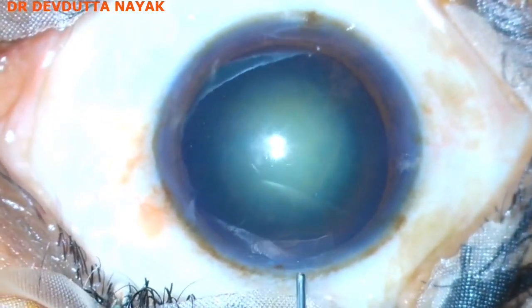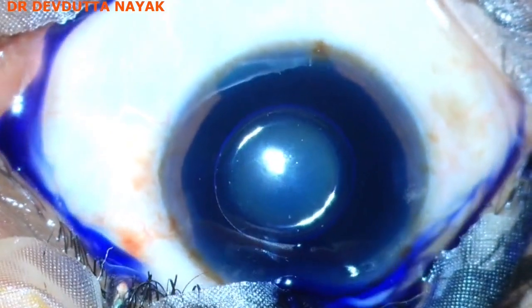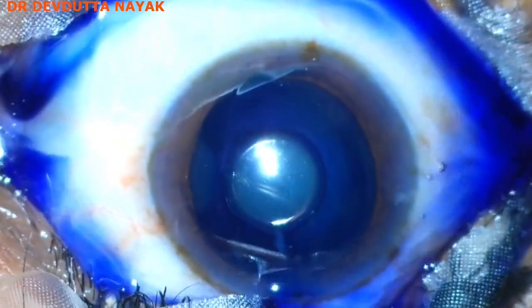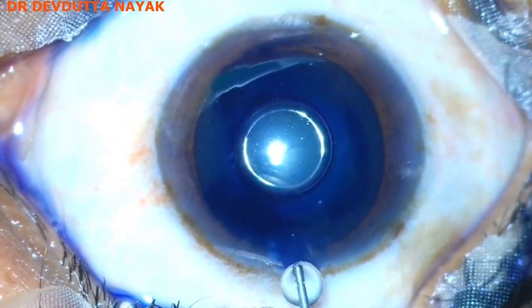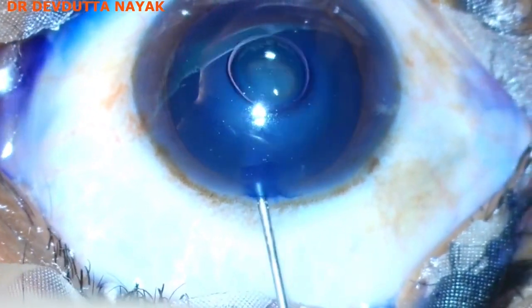The anterior capsule is stained with trypan blue dye under air, and after washing the dye, the chamber is formed with 2% HPMC.